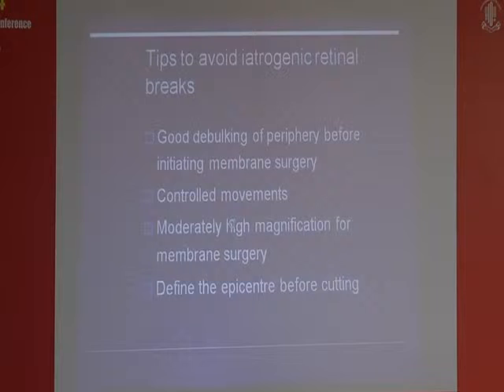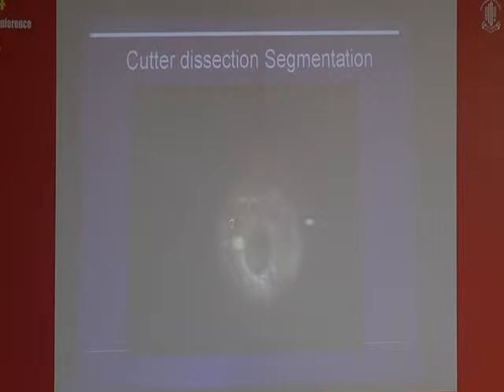It's important that we do good debulking of the vitreous before we proceed to the membrane surgery. The movement should be more controlled. The magnification should be higher when we are dealing with these membranes, and we should be defining epicenters before using the scissors.